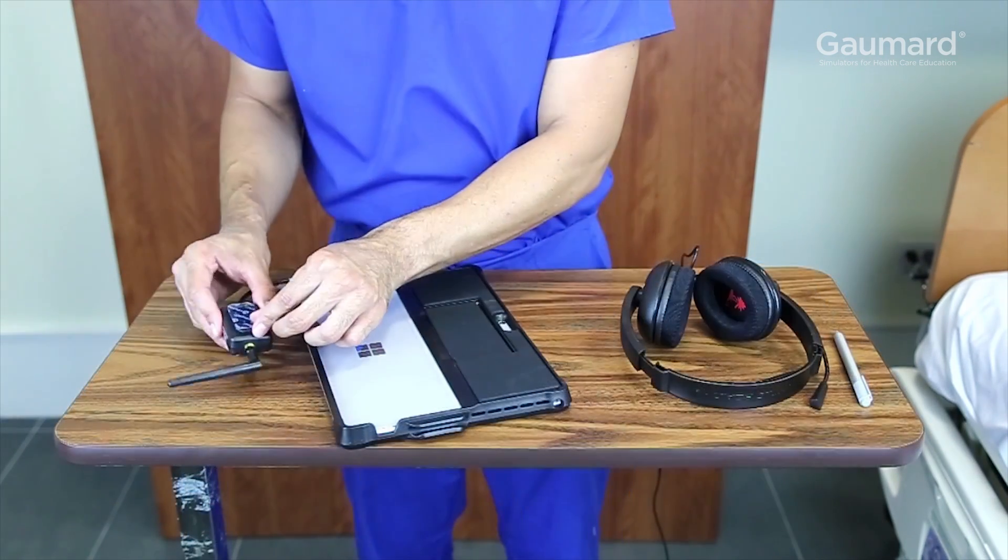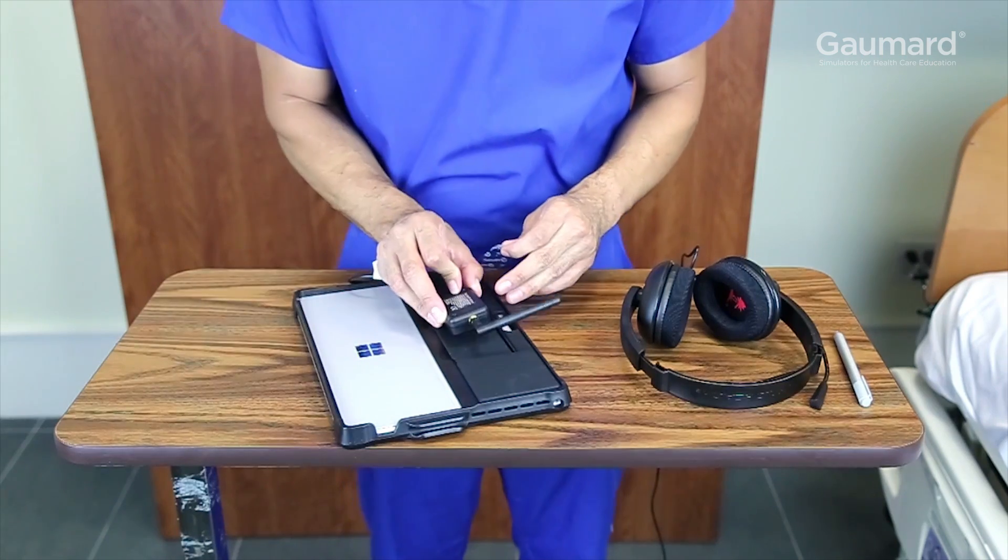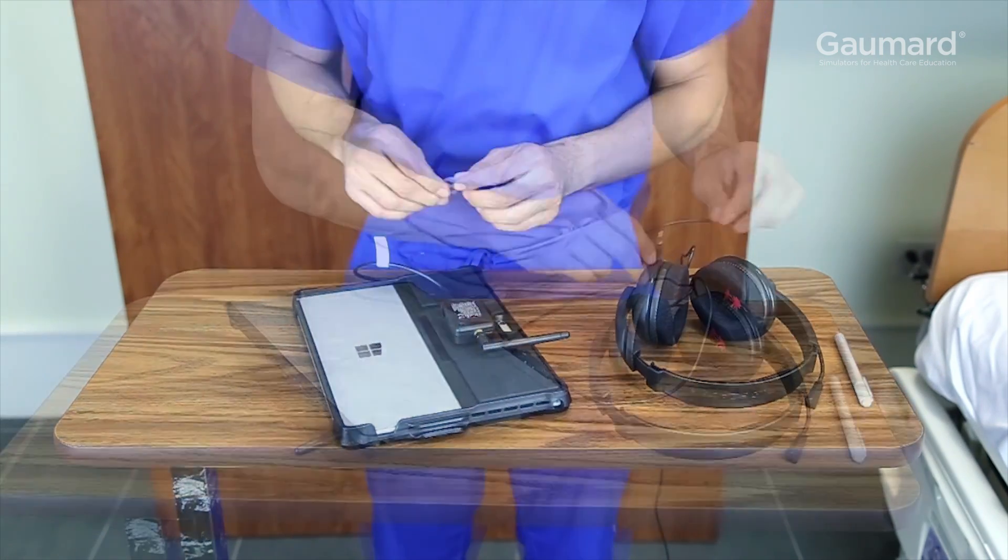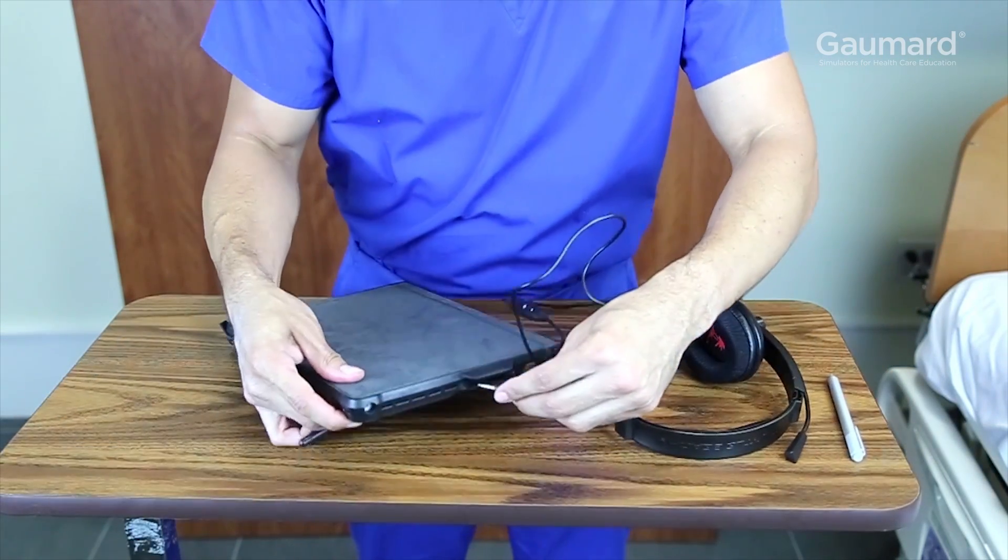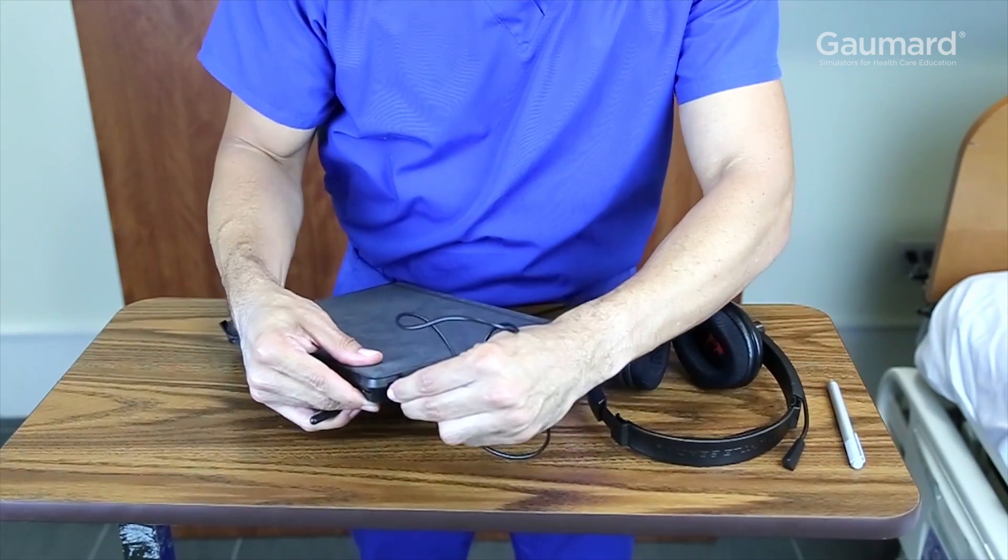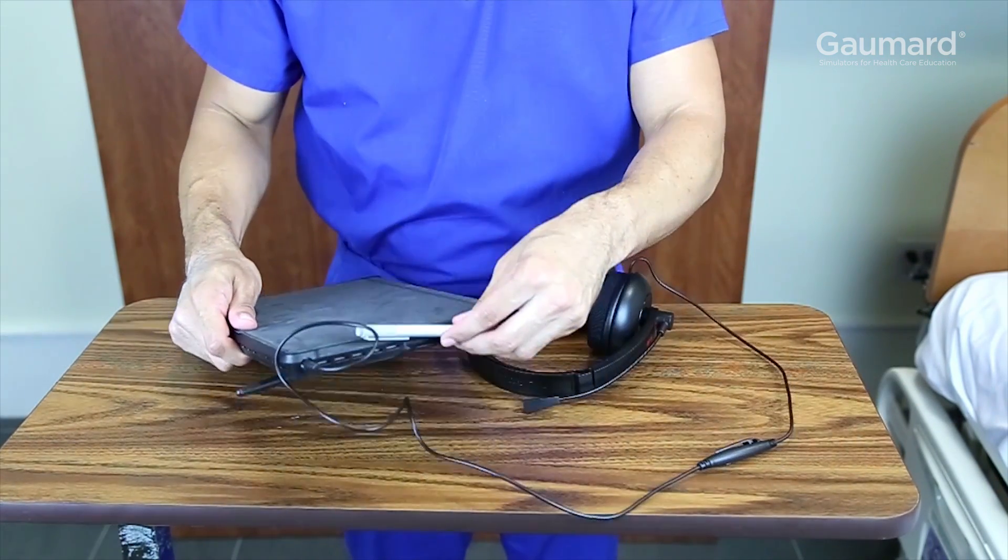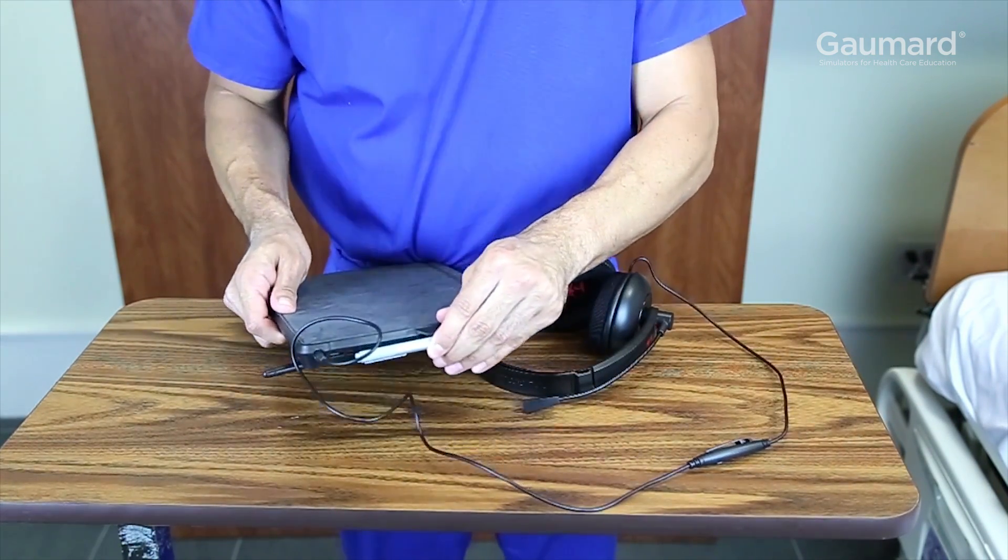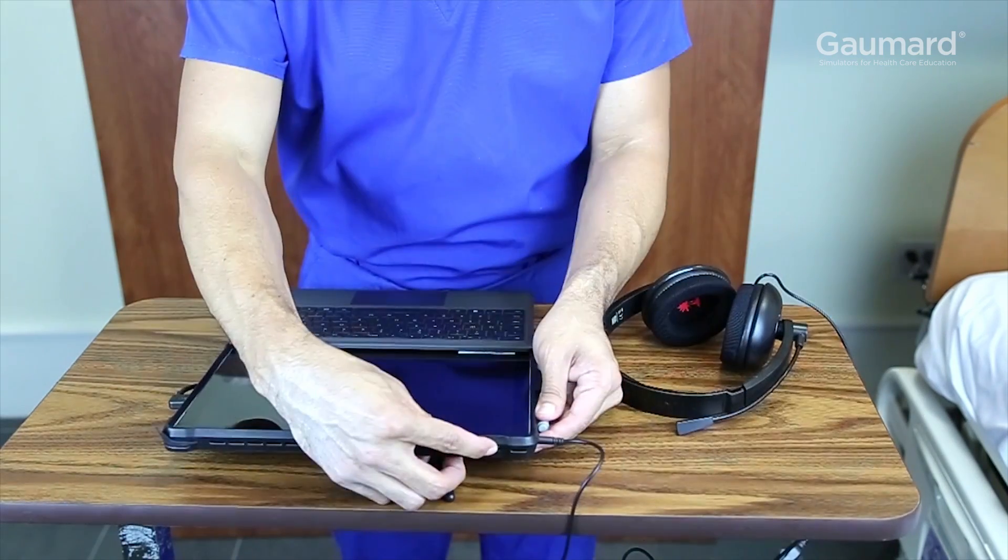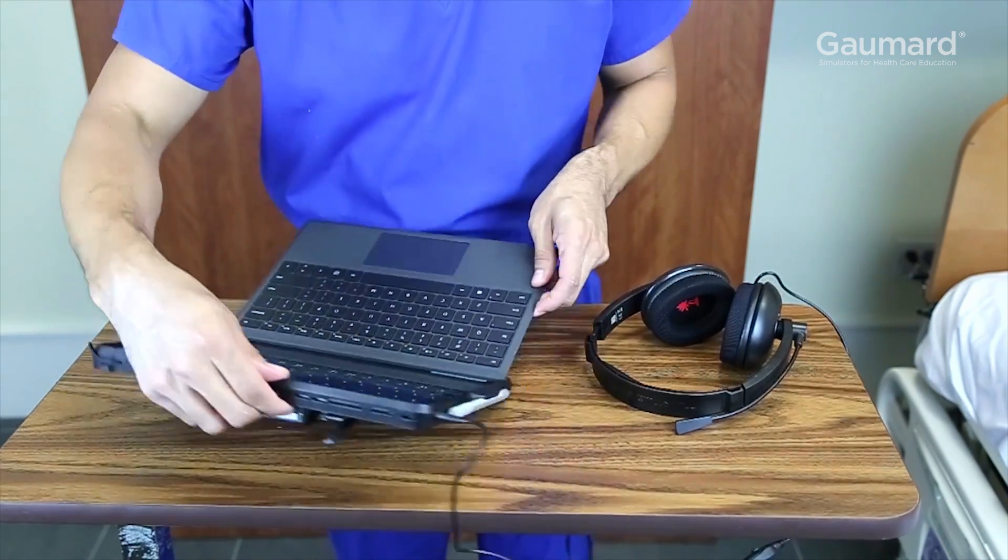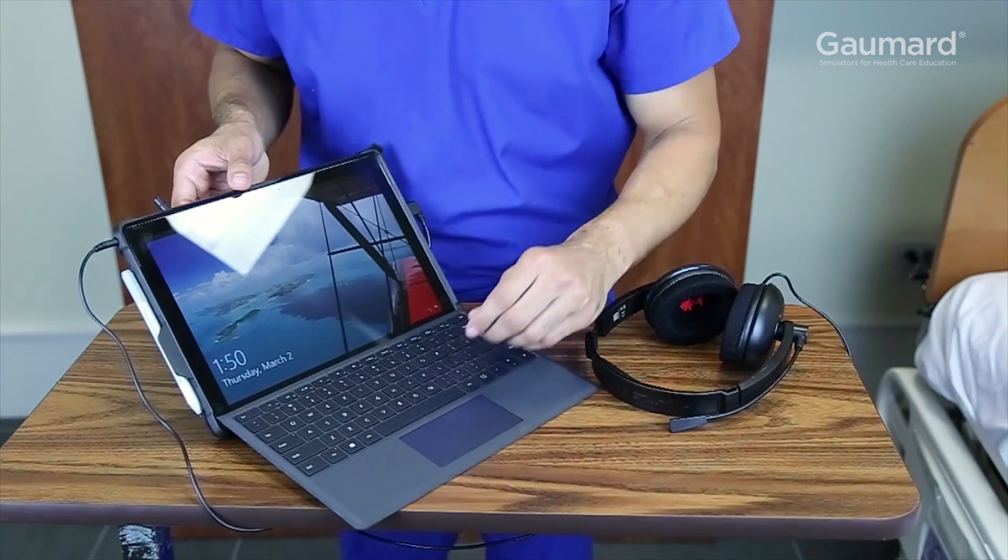The RF module has an adhesive strip. Remove the strip and adhere it to the back of the tablet case. The streaming audio headset plugs into the upper corner of the left side of the tablet. The stylus, when not in use, is held in place by the holder on the left side of the tablet. Press the power button in the left corner of the upper side of the tablet to turn it on.